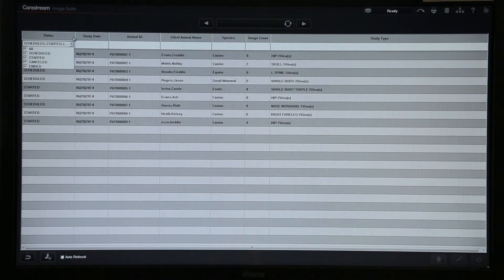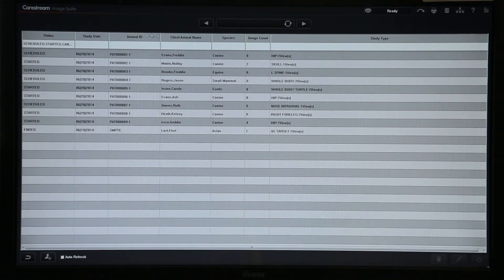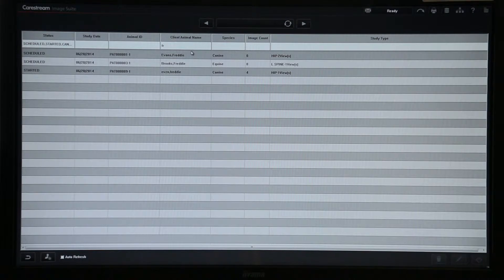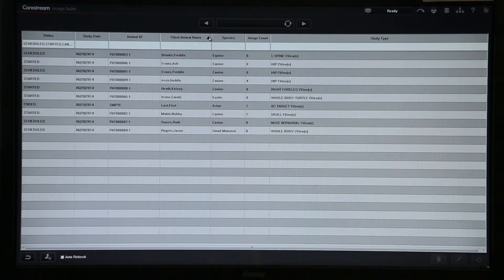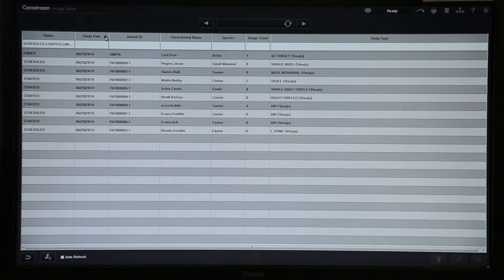I've set it to all to show everybody, then I'll click into one of the other boxes. You can also click into client/animal name and type part of the animal's name and hit return, and it'll search down to patients with that name. Alternatively if you clear that box you can have them in reverse or ascending order, and you can also do this by date — so if you remember you X-rayed a patient on a specific date but not their name you can search by the date.